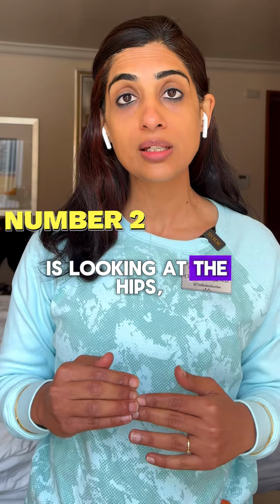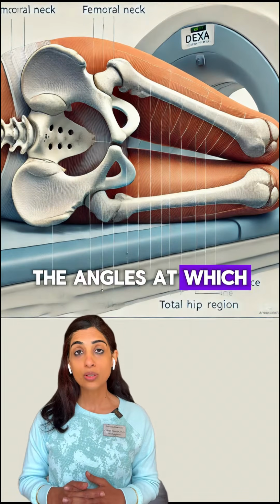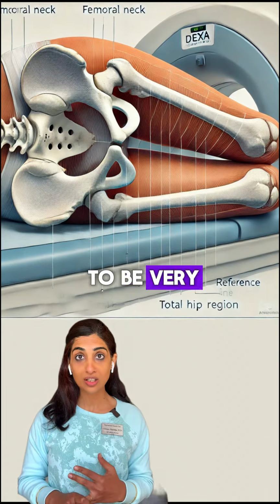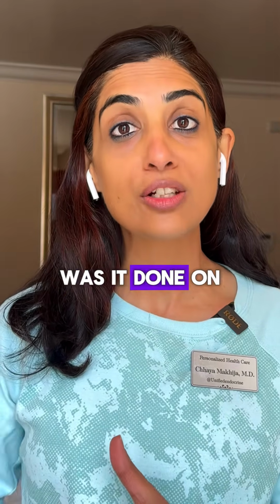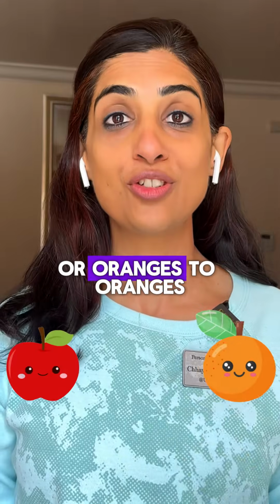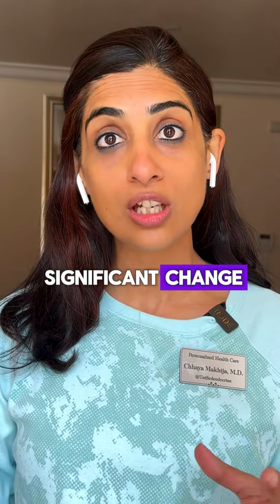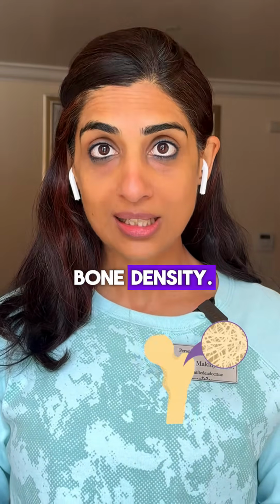Number two is looking at the hips. The hip alignment, the angles at which the bone density was measured in the femoral neck as well as the total hip, is going to be very, very important. If there is a prior bone density, was it done on the same machine? Because a comparison is more like apples to apples or oranges to oranges for us to understand if there's been a significant change or a significant improvement or decline in the bone density.